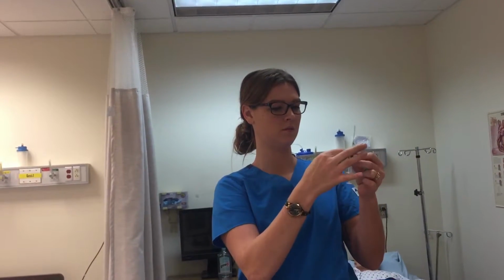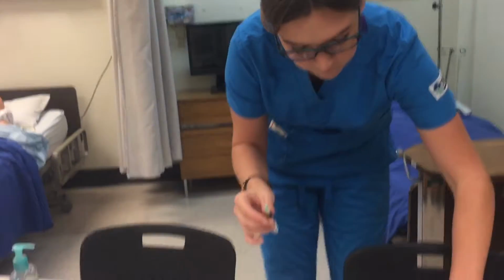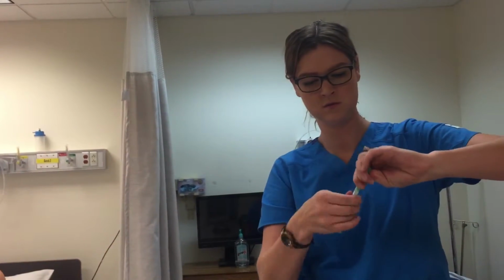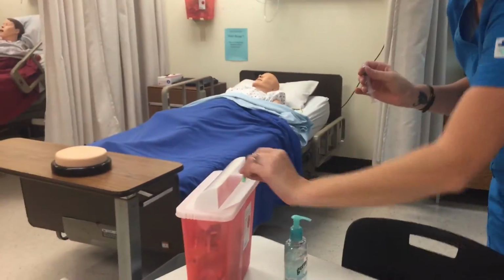Okay. Now I'm going to use the scoop method to recap my needle. And then I would change out my needle. I would put this in the sharps.